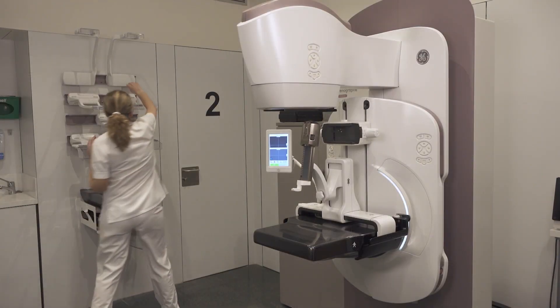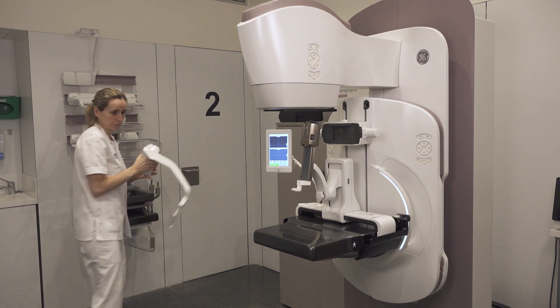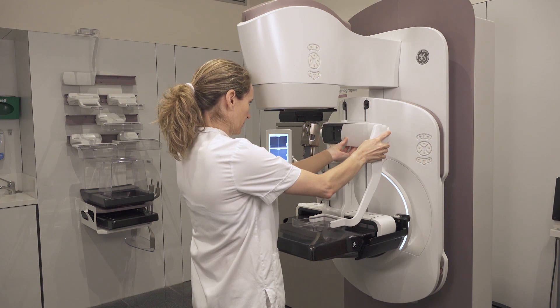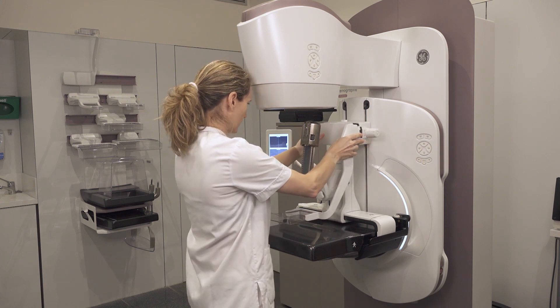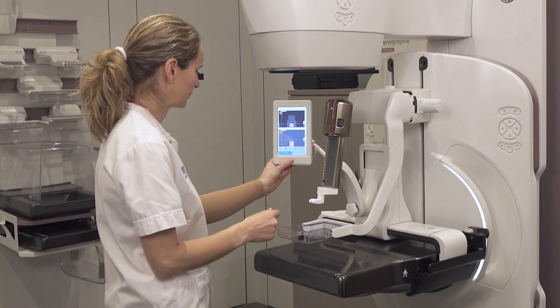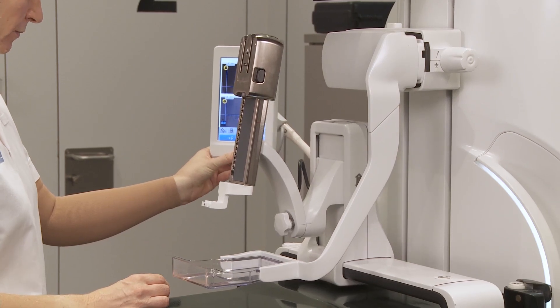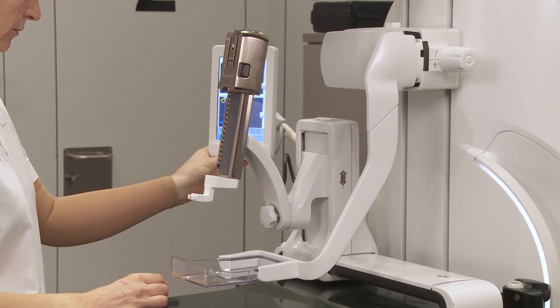To proceed with the horizontal approach, left access: the left paddle arm has been removed. The biopsy head is in vertical parking position and the right paddle arm is attached. Go to parking again and switch to the horizontal approach using the knob.